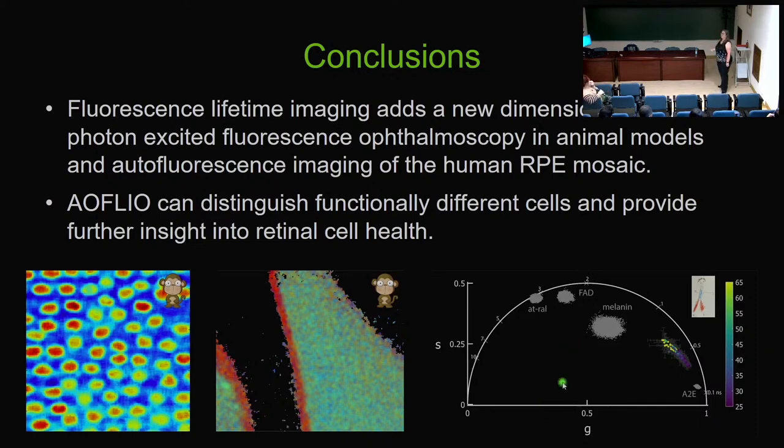And so what we need to start doing next, once we get the systems up and running in Waterloo, is start broadening and start looking at more diseases, more potential things. And again, in the mouse models, when we look into two-photon fluorescence, we look at very specifically targeted diseases with genetic mutations where we know what we should be expecting, and use that information to help guide us in interpreting data in diseases that are not as well characterized.